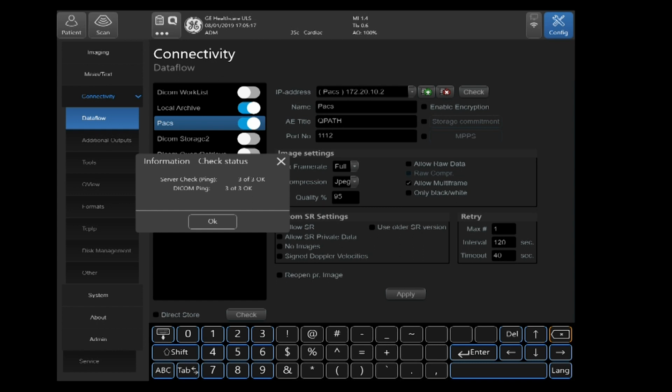If you do not get a good server check, that indicates you have selected the wrong IP address. I would go ahead and go to your IP address field and make sure you have the correct device selected and you have the correct IP address. If you do not get a good DICOM ping, this could indicate you have an incorrect AE title. Again, these are case sensitive, so you have to make sure it matches the device you are sending to exactly. For the port number, again, you have to make sure that matches as well. These will cause a communications failure in the DICOM ping.